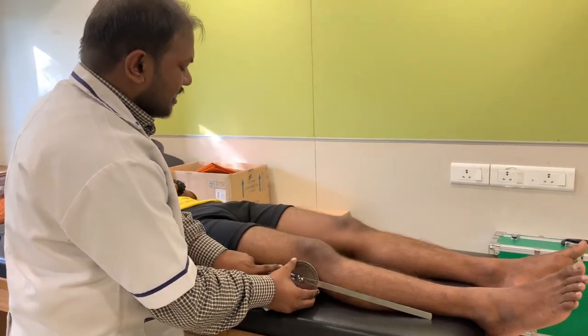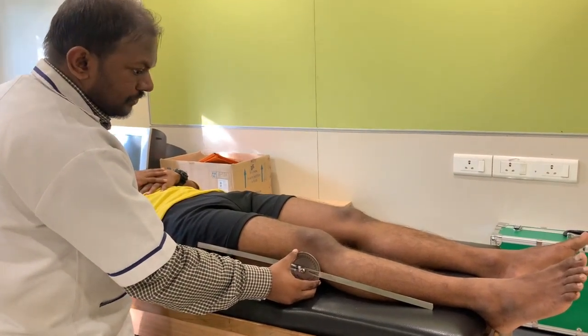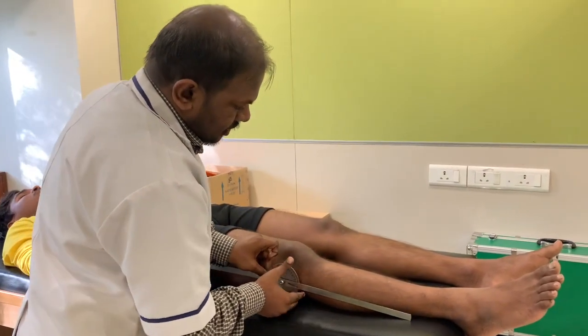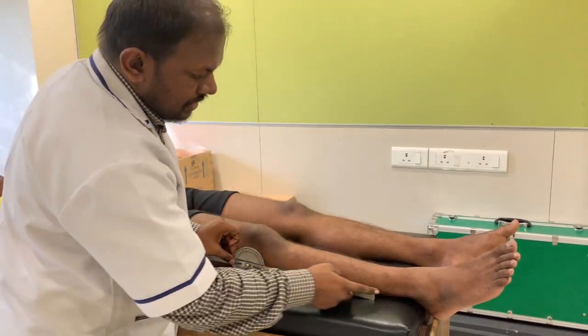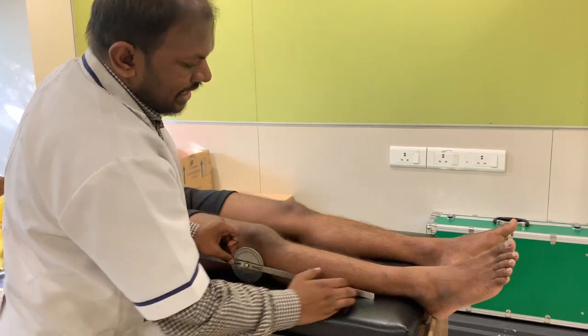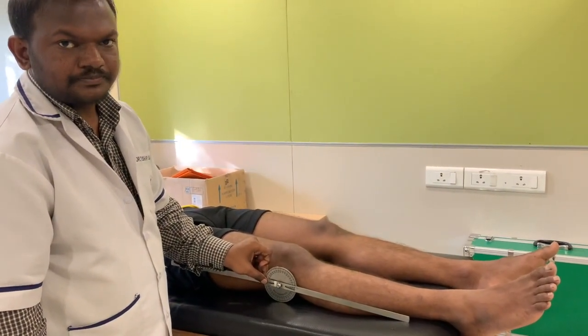Then your stabilizing arm is pointed towards the greater trochanter of the femur, and your movable arm will be parallel to the lateral aspect of the leg and will be pointing towards the lateral malleolus of the fibula.